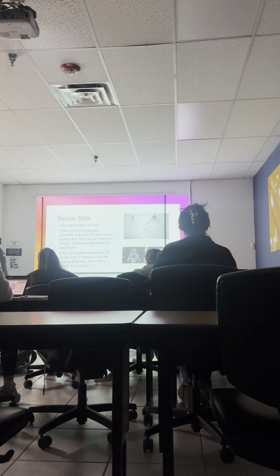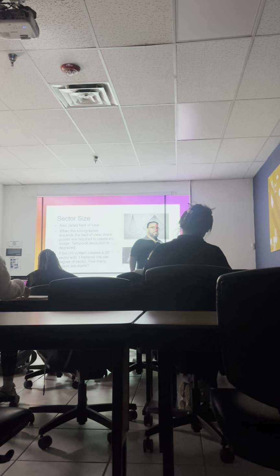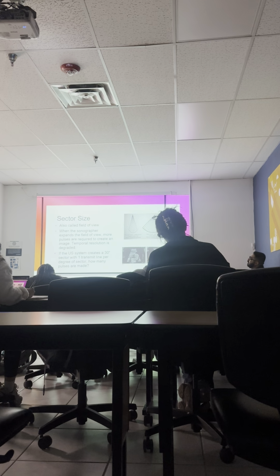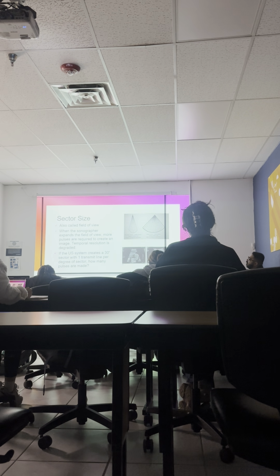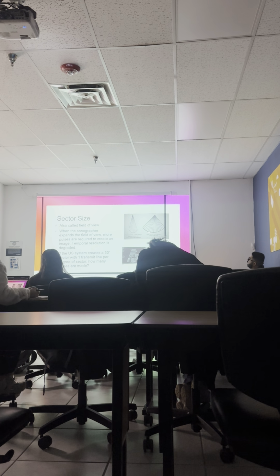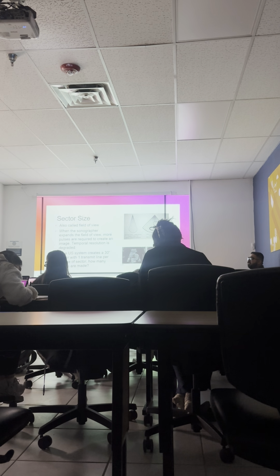Okay, now we have our sector size. It's also called a field of view, or FOV. Field of view, FOV, same thing. Okay, so when the sonographer expands the field of view, more pulses are required to create an image. Okay, so here we have a smaller sector size, right? So this one's 90 and this one's 45. Which one has a better temporal resolution? 45. Yeah. Okay. So when is this beneficial for us to use? What do you guys think? The heart.